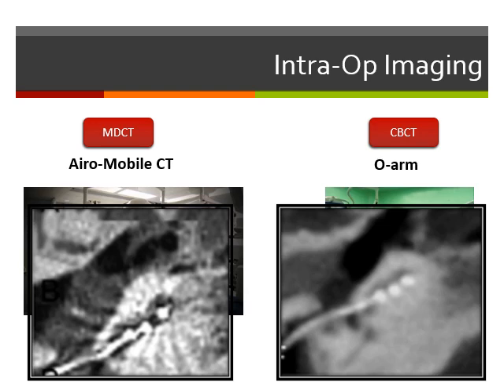So as a preoperative evaluation or as a post-operative evaluation for children, multi-detector CT could provide us with better information. However, intraoperatively, cone beam CT might be the better option if it is available.